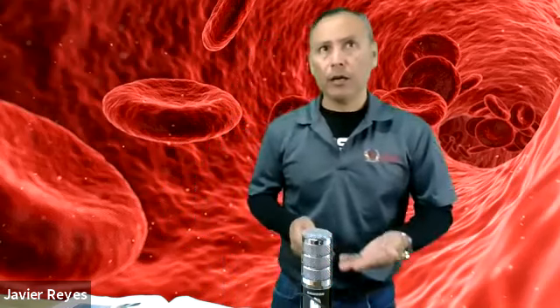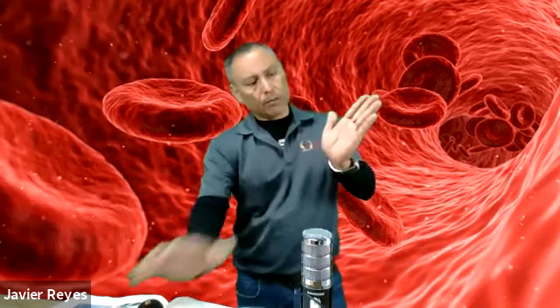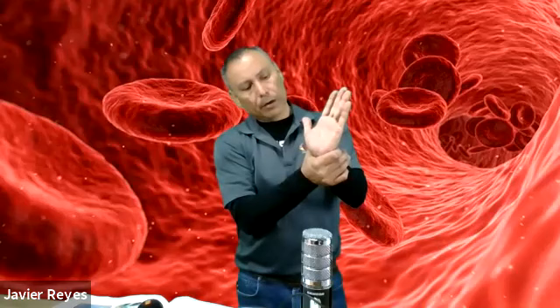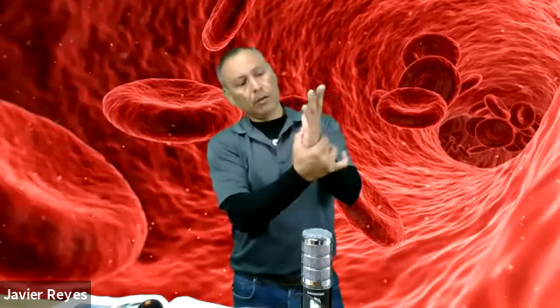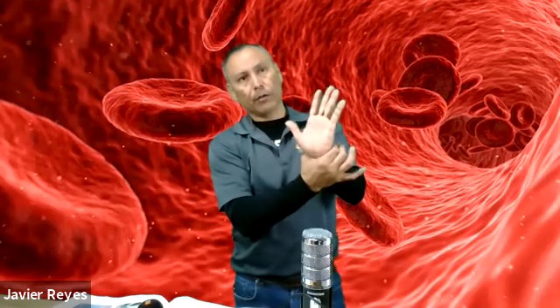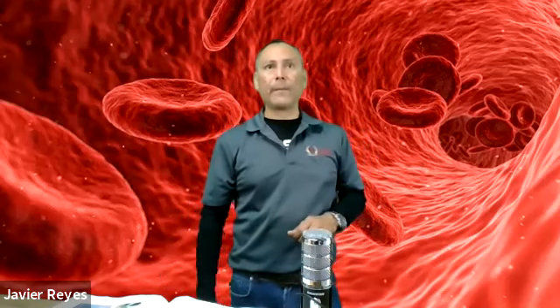Grasp the patient's finger between your non-dominant thumb and finger, or the heel. If you're grasping the heel, grasp the foot gently by the heel. You're going to be compressing and releasing. You can also encircle the heel, so that it allows you to create pressure on the heel to get more blood flow going.